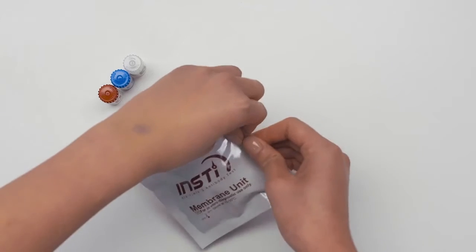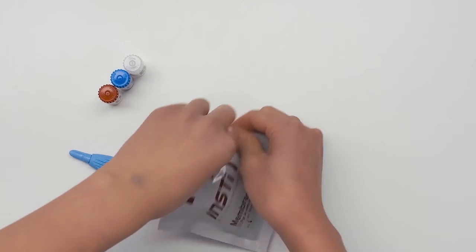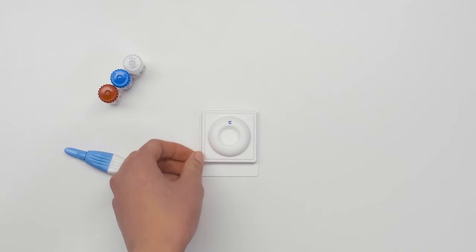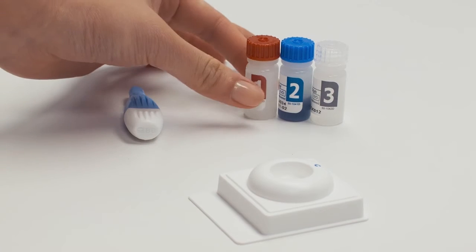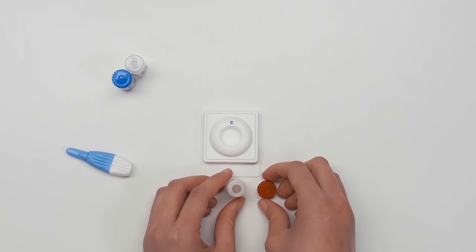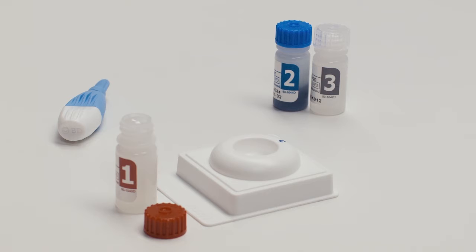When you are ready to start, open the test device pouch. Place the test device on a flat surface in a well-lit area. Remove the cap from bottle 1 and place the bottle on a flat surface with care. Place the cap nearby to recap the bottle after you add the blood.